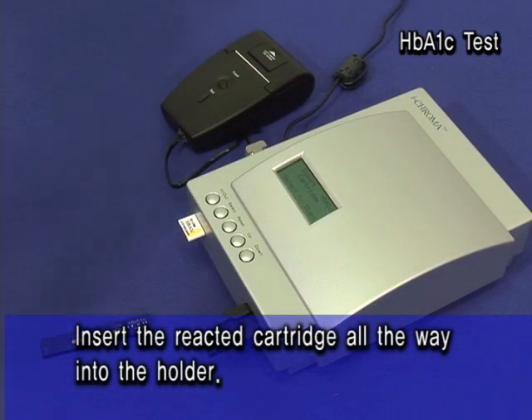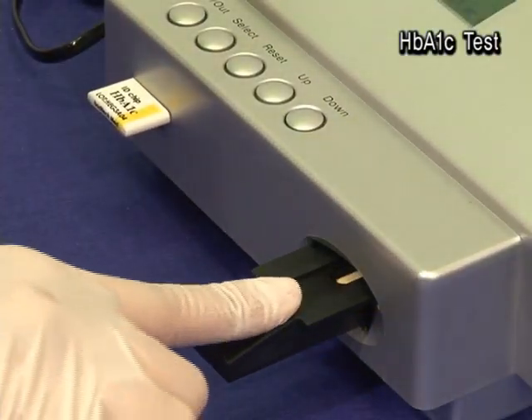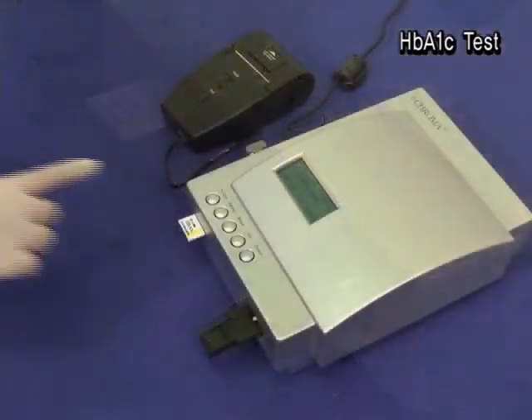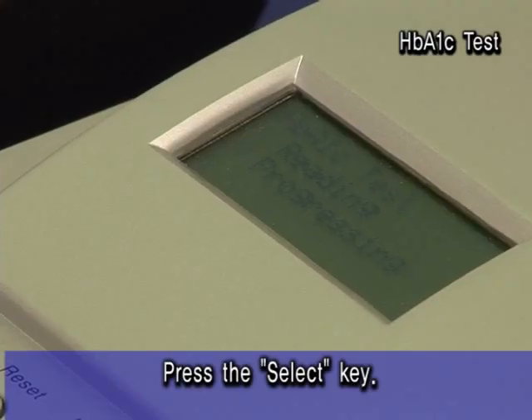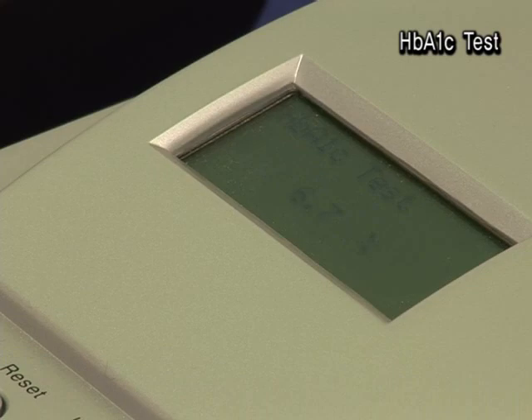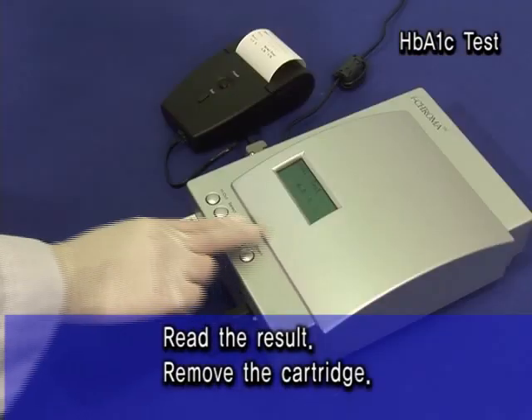Insert the reacted cartridge all the way into the holder. Press the SELECT key. Read the result. Remove the cartridge.